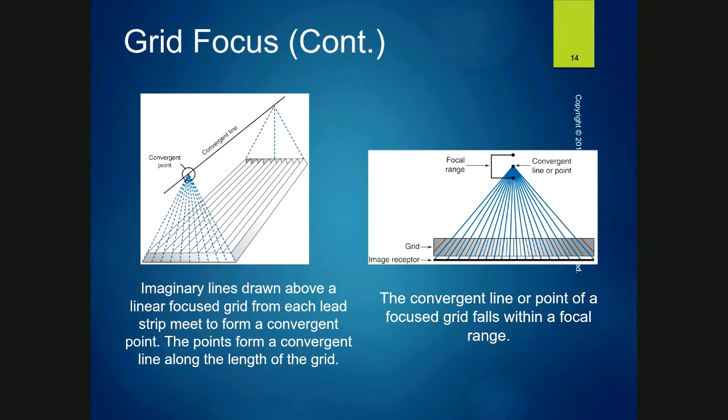There is a sweet spot, so to speak, where most grids have a focal range of 40 to 72 because they want you to be able to use them for everything. They don't want to buy one that has a focal point of 40 inches and a different one at 72, and you have to change out the grid depending on what you're doing. I know they have that in some rooms at Moore. In the ED, the GE room has that, where you have to change out the grid.